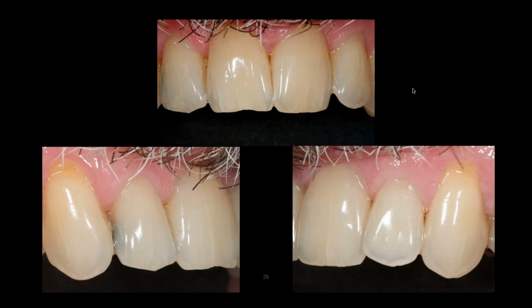When you have zirconia, the grains are so tiny, I believe they're like 0.2 of a micron for some of the 3Y zirconia. And they get a little bit bigger as you go to more cubic zirconia, which will allow a little bit more light. The grain boundaries are also super, super tight, so that the light just can't go in and move around like it does on a natural tooth or a glass ceramic crown like a lithium disilicate or lithium silicate or whatever you want. I mean, you could do a feldspathic veneer and a VITA block.